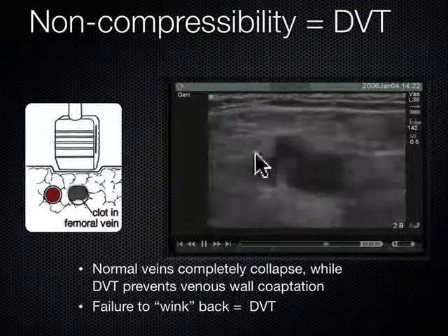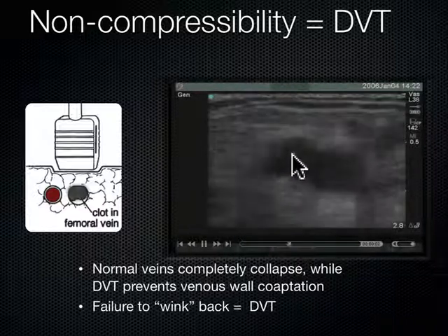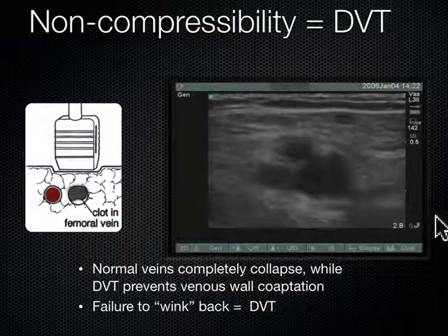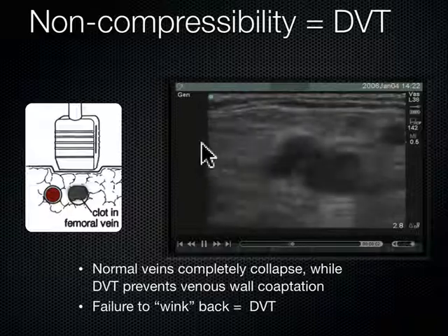Okay, which leg is this? Correct, the right leg, because the vein is here, venous, penis, and this is lateral over here.